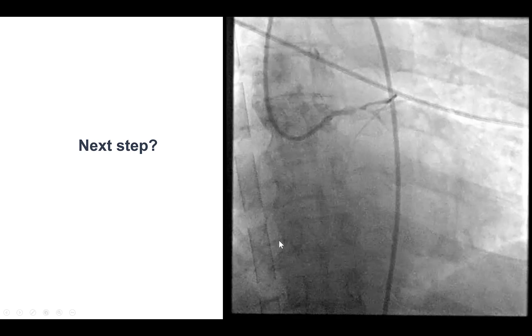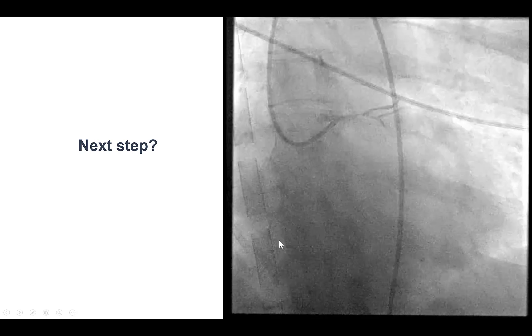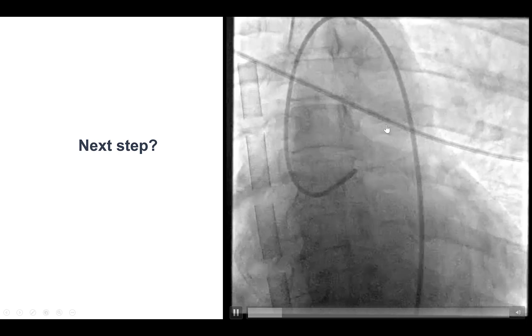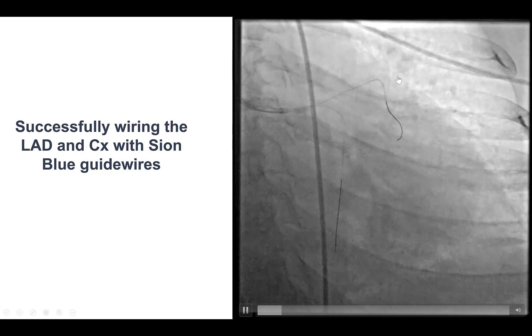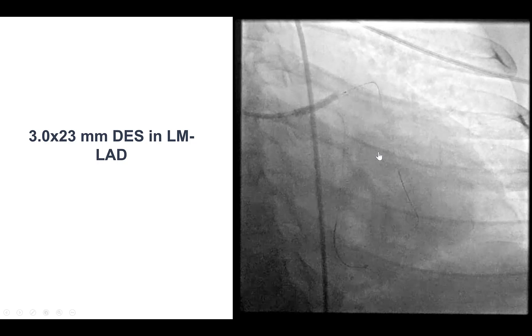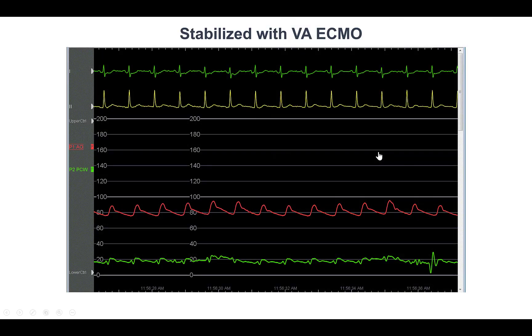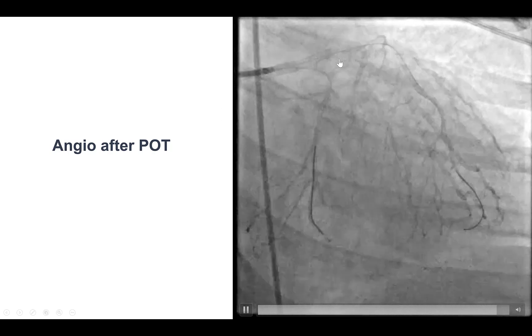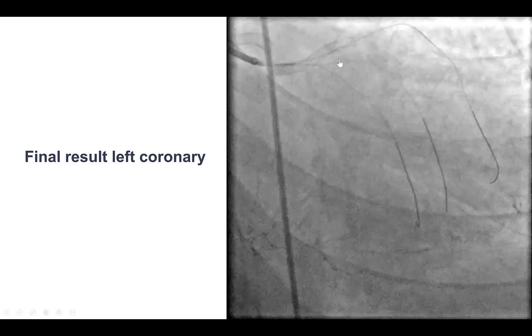What is the cause of this hemodynamic deterioration? We did have an acceptable result of the right coronary artery when this happened. It all became clear when we performed another injection on the left main — what was found is that the left main had a dissection. Fortunately, unlike the right coronary artery, we were able to advance workhorse guidewires into both the LAD and the circumflex, then predilate and stent with a 3.0 drug-eluting stent from the left main into the LAD, which resulted in restoration of antegrade flow and restoration of pulse pressure. We performed the proximal optimization technique and now have excellent flow. There is still some residual disease in the LAD that was covered with another drug-eluting stent, and a nice final result was achieved with TIMI flow to the left main.